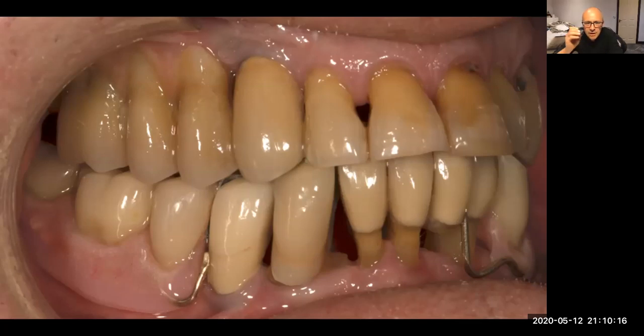This is the denture in place at the top. Here we've got his natural canine. And then this is the artificial teeth on that free end saddle with the implant supporting that upper denture.